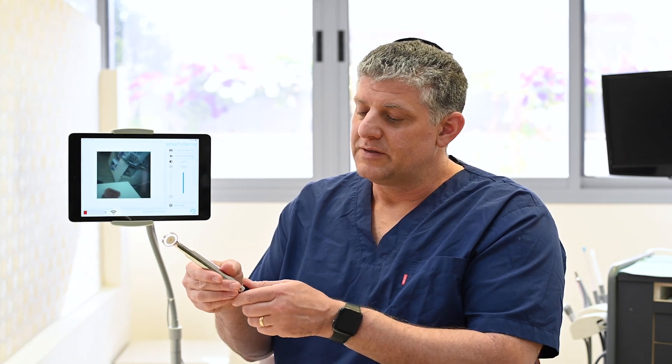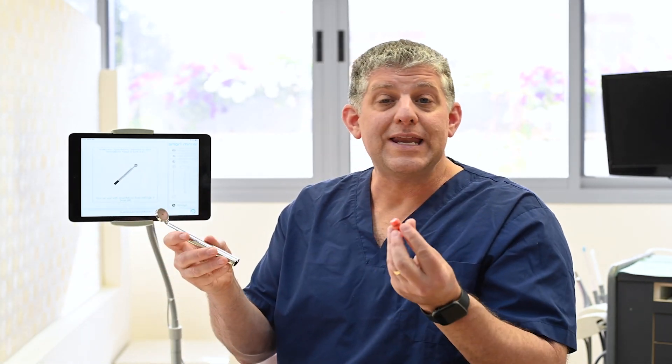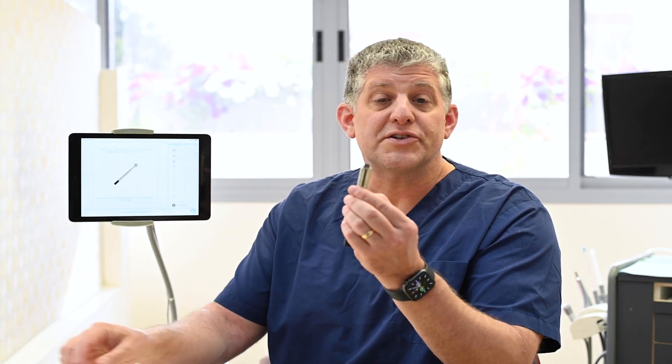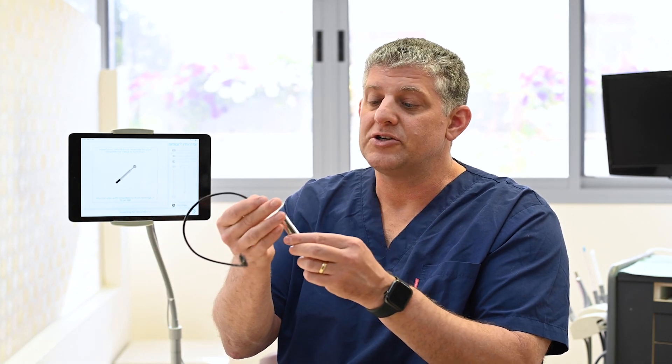In this video, I'll review cleaning, sterilizing, and charging SmartMirror. To turn SmartMirror off, start by taking the streamer out of the SmartMirror head. Take the lightly lubricated end cap, fully insert it into the SmartMirror head, and it's ready for cleaning and sterilization. To charge the SmartMirror streamer, use the enclosed USB-C charger.